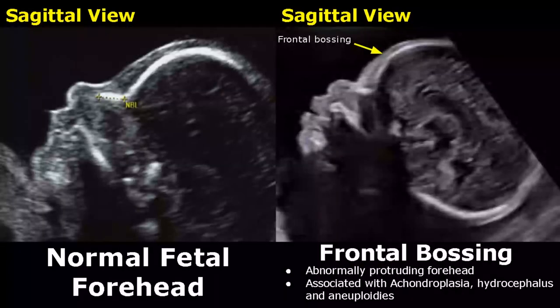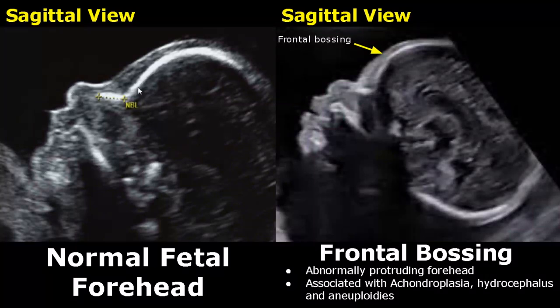This is a sagittal view showing a normal fetal forehead. And over here is a case of frontal bossing, in which there is an abnormally protruding forehead — you can see an increased convex curvature of the forehead. It is usually associated with achondroplasia, hydrocephalus, and aneuploidies.